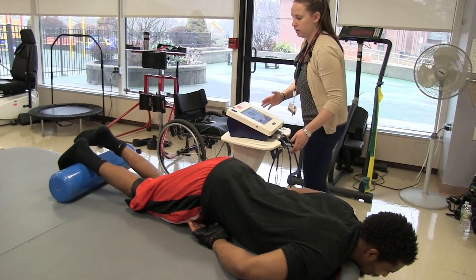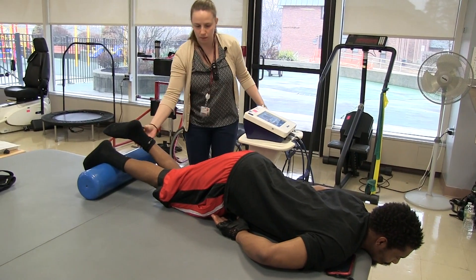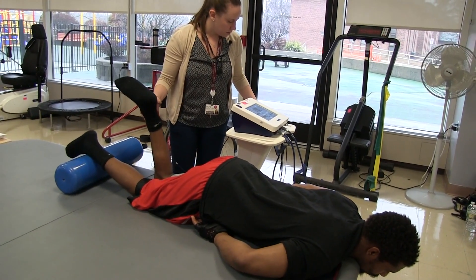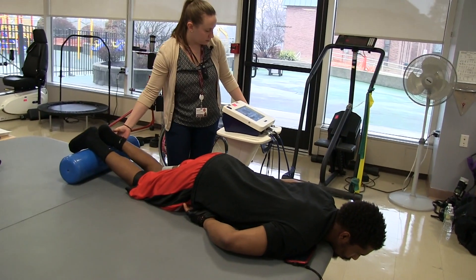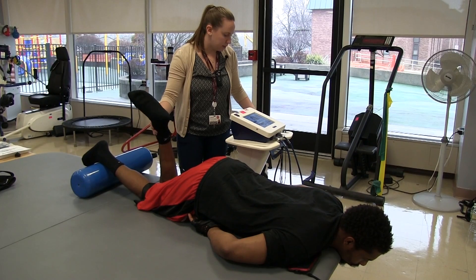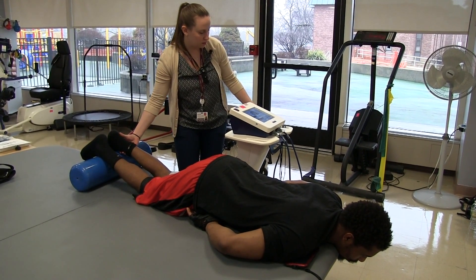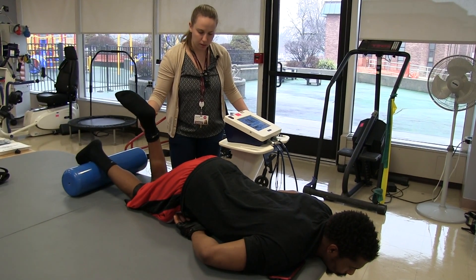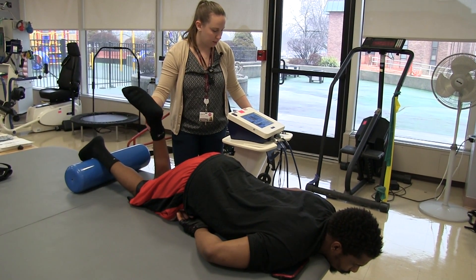Curl it up. Good. Curl up. Good. And down. That's the pattern, okay? Curl up. Good. And down.